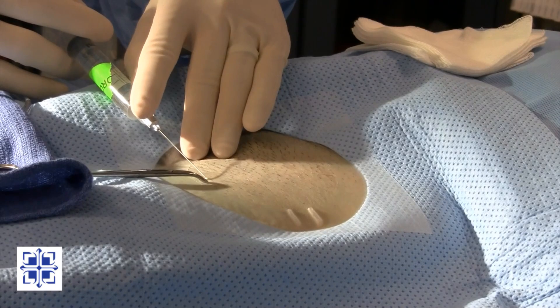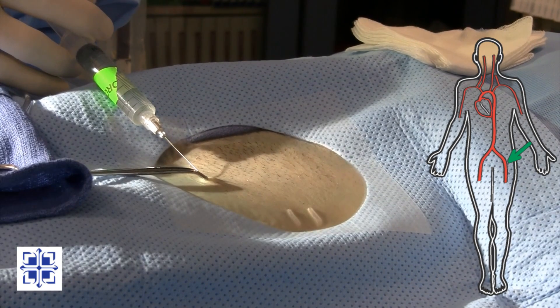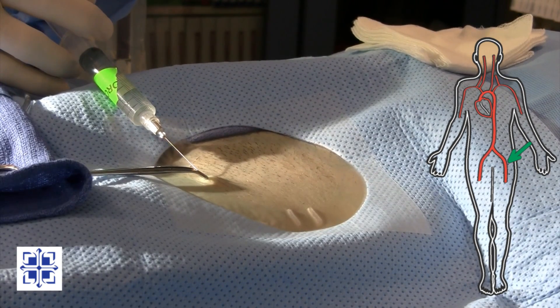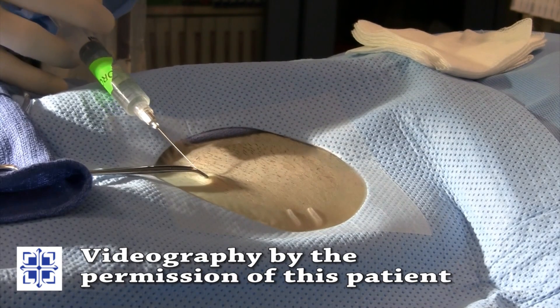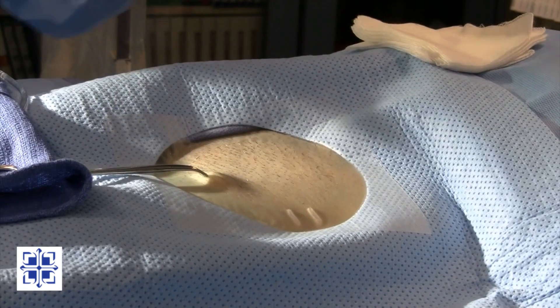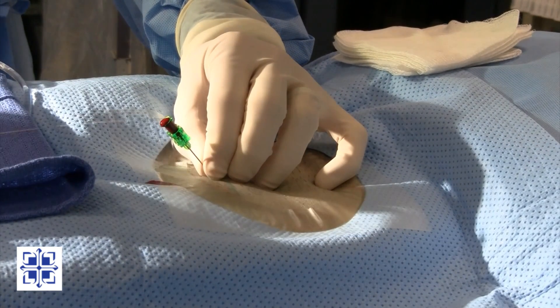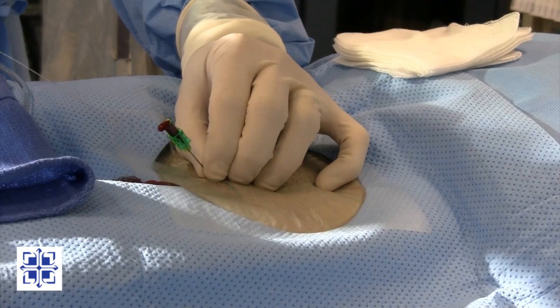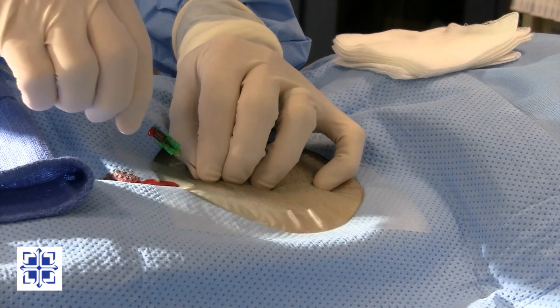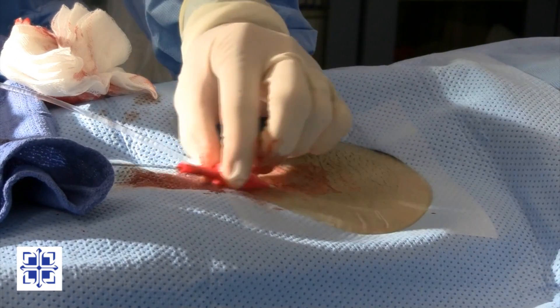The next 60 seconds demonstrates an angiogram being started and shows a small amount of blood. We will be working from this man's left groin. We enter the vascular system through the femoral artery. Here I am numbing the skin overlying the artery with the local anesthetic lidocaine. This is the most uncomfortable part of the angiogram and feels like a small pinch and a brief burn. An area about the size of a quarter is numbed from the skin to the surface of the artery. Once numbed, I place a small needle in the artery. Through the needle I introduce a small wire, which I exchange for a larger wire, and in turn for a sheath that I use to pass a catheter into the body. Now we can begin our exploration.